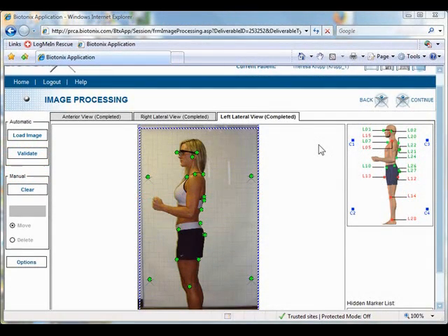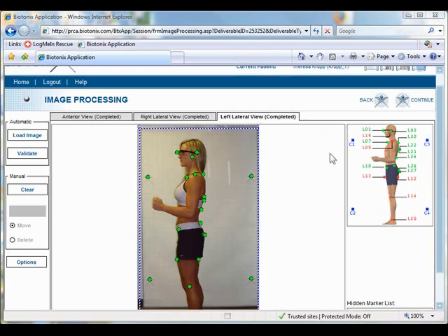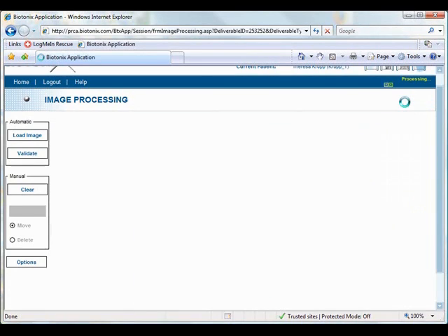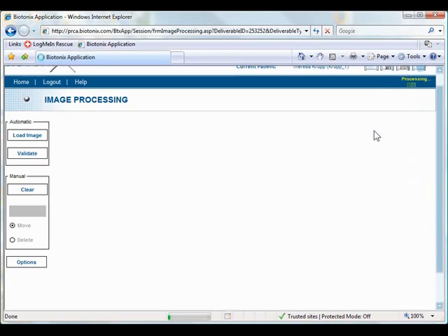Okay, so now, once we've digitized those markers on the patient, the next step is we're going to go ahead and hit this button continue. In real time, it's going to transmit the data over to the servers, and it's not transmitting the images, it's transmitting the digitization points, so it's totally HIPAA compliant.